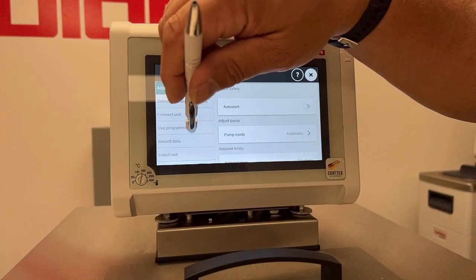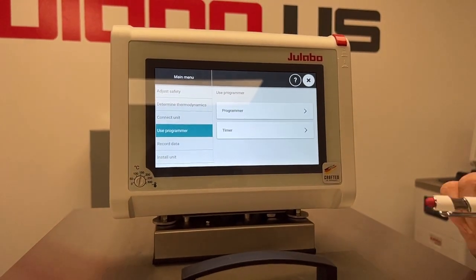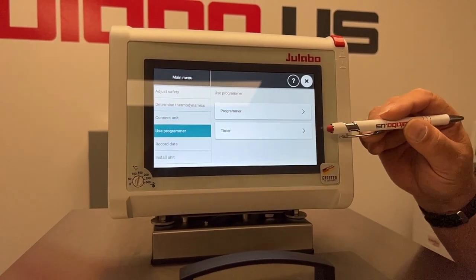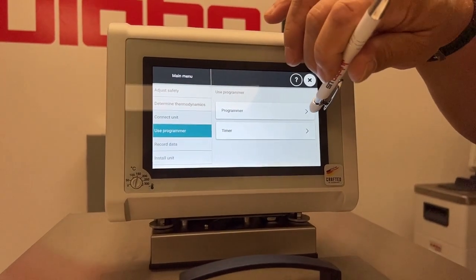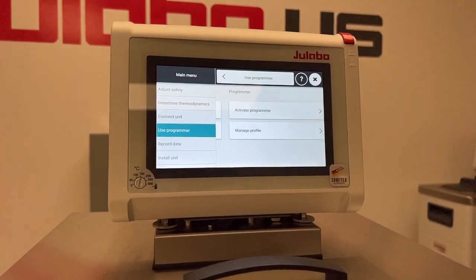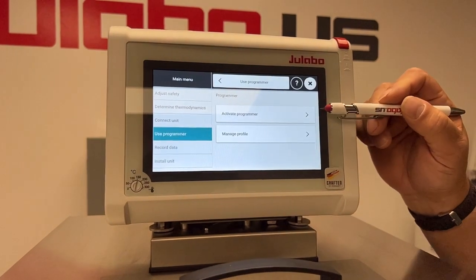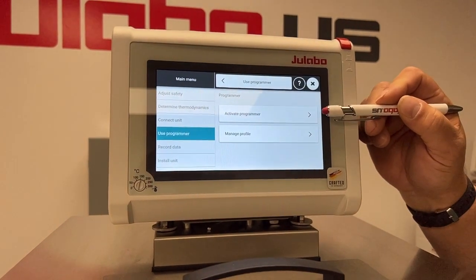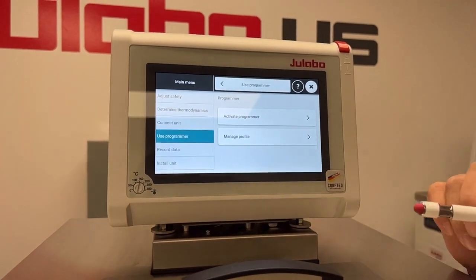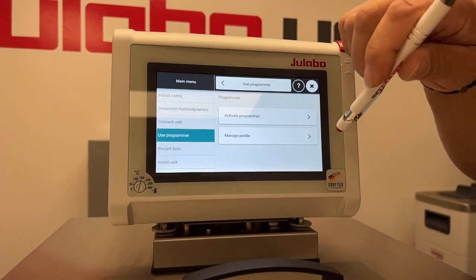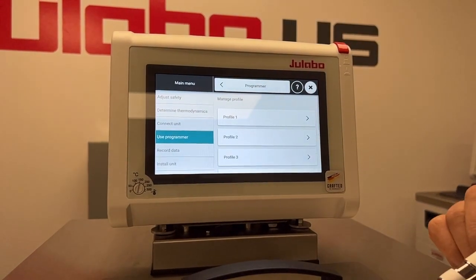So you hit the menu key and press Use Programmer. You're going to see two options here: Programmer and Timer. We'll go into the Programmer first. Underneath the Programmer menu there is Activate Programmer and Manage Profile. So let's go show the Manage Profile.